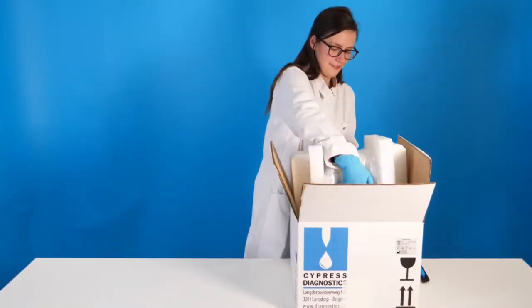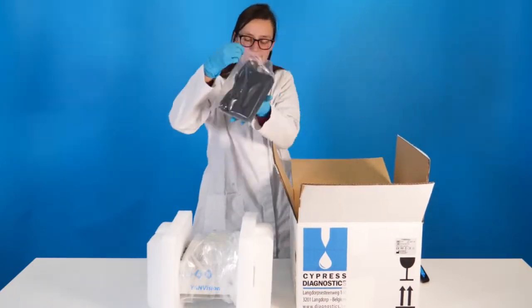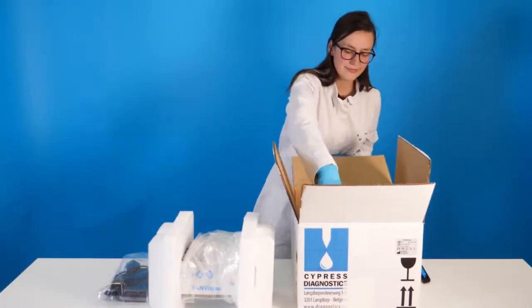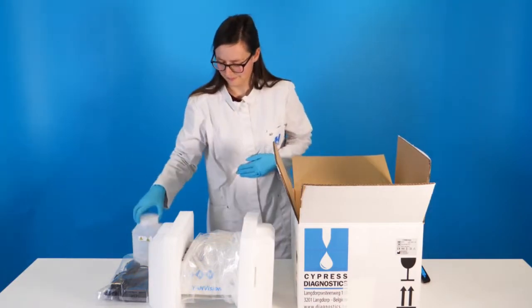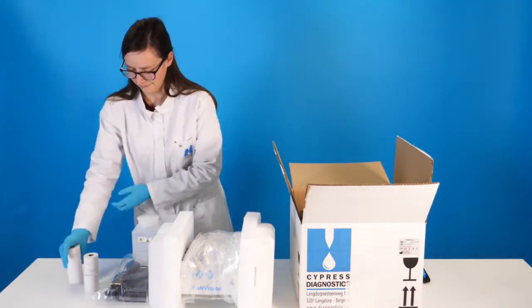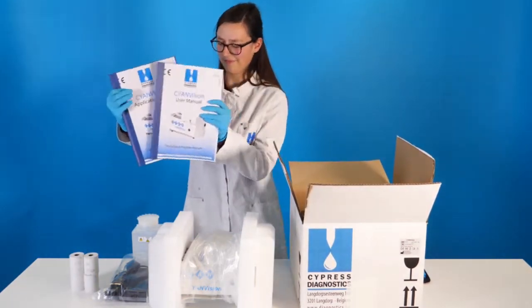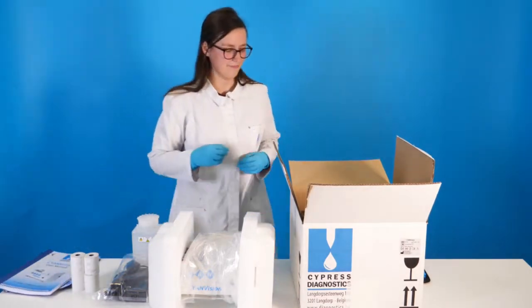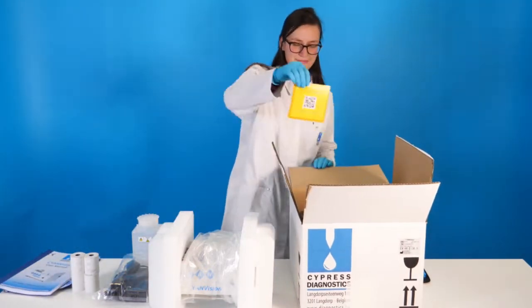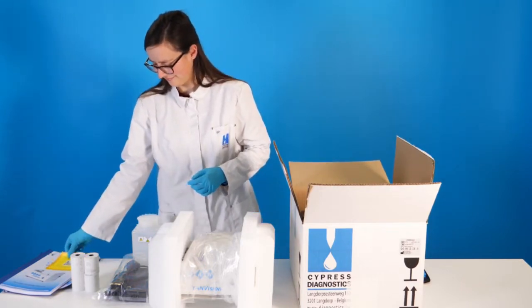In the box we find the CyanVision analyzer, a power supply with power cord, the waste bottle, four thermal printing paper rolls plus one that is already installed, the user manual and application sheets, and an important notice with a QR code to register your device and find more special insights on our website.